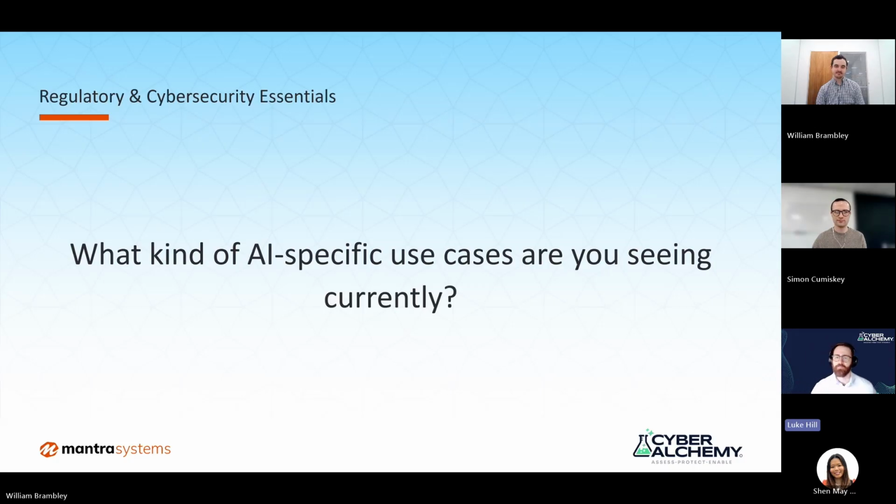Yeah, absolutely. I think so. A lot of the stuff that we see that has got AI embedded at the minute is still very much a software thing. But even there, there's lots of different models for deploying the AI system, right? So you've got AI which can run on the device itself. And like we talked about that ultrasound machine earlier, that's how that works.